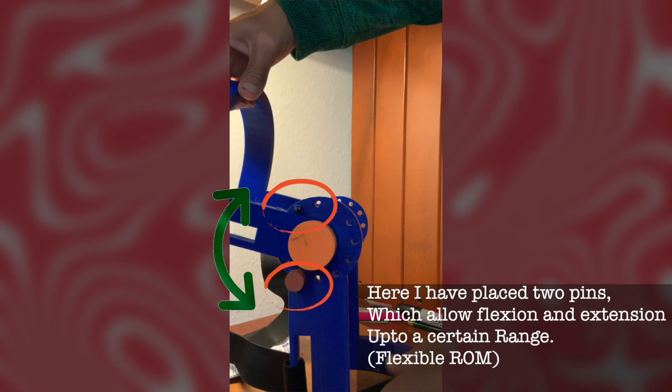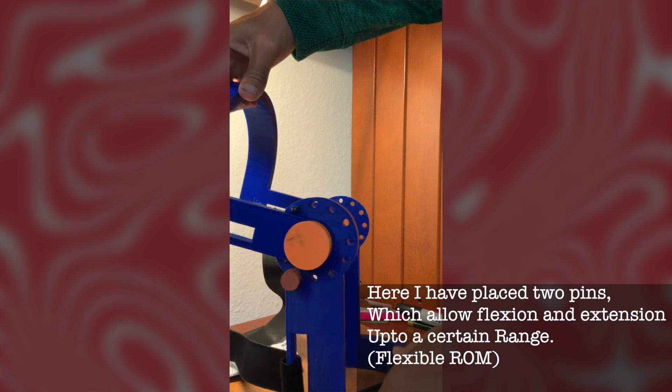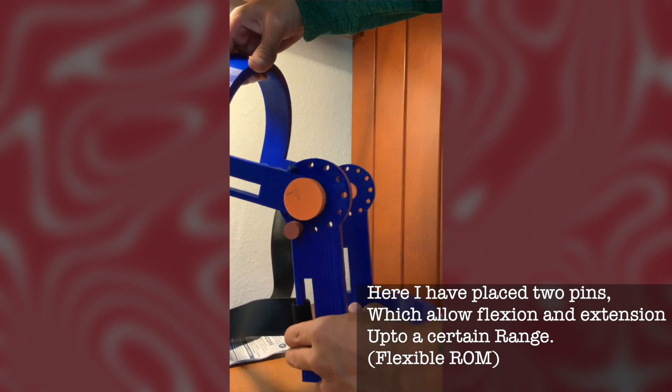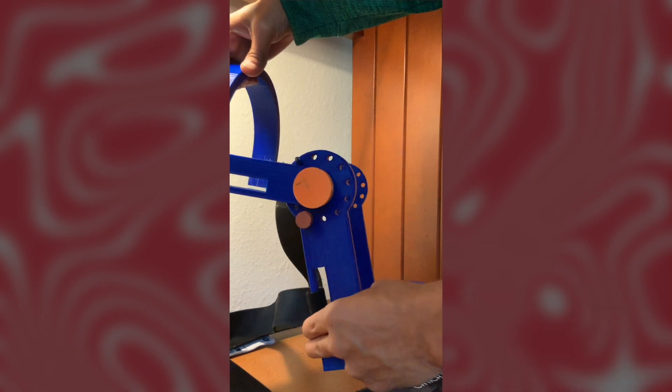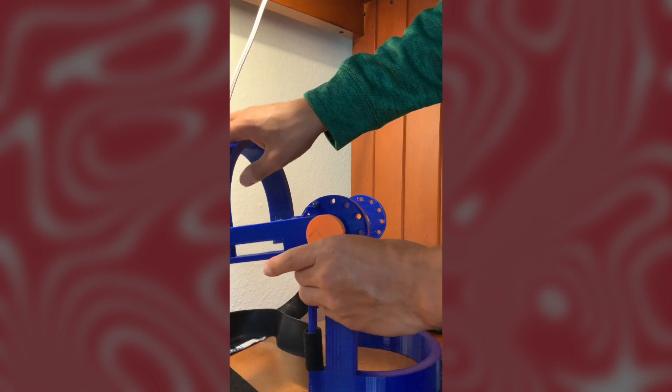In this setup, I'm using two pins, which allows the brace to move within a limited range of angles. The two pins block the lower half of the brace from moving in either direction, allowing limited flexion and extension.